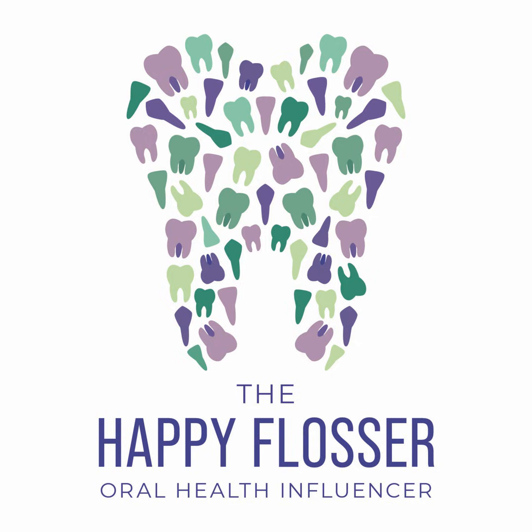The other thing that you can notice on a radiograph is that crown to root ratio. If there has been bone loss, it will help you determine the crown to root ratio for the stability factor of that particular tooth. And then the radiographs also help us with the bone loss that can be evident around our implants. So some of the early bone changes that we see.